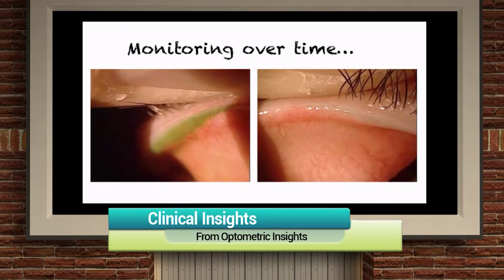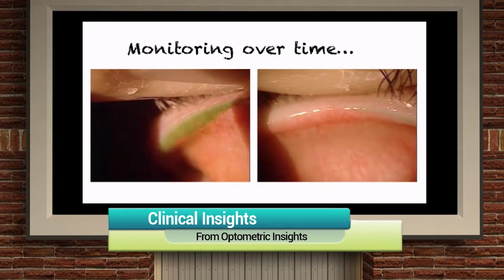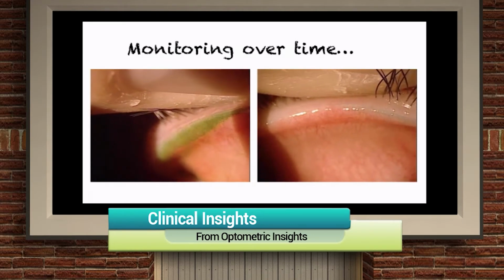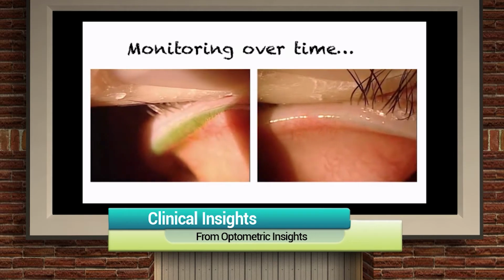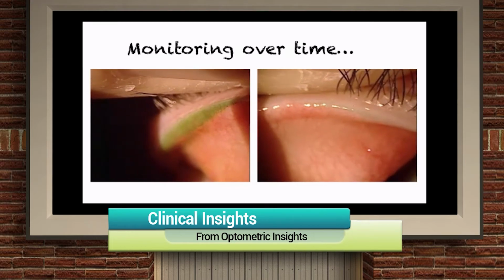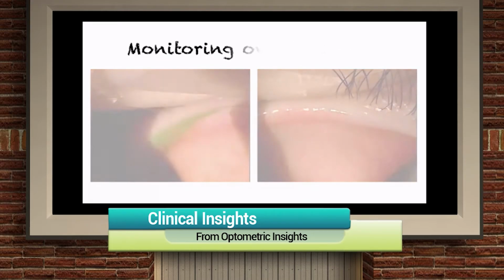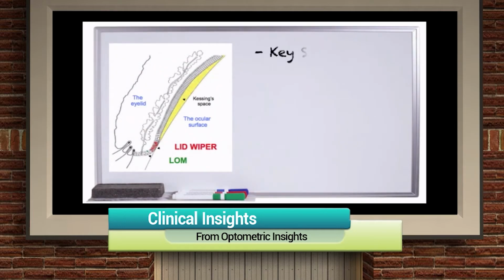In addition to assessing lid wiper area to uncover epitheliopathy, it is also valuable to monitor it over time as you manage your dry eye patients. In this patient in particular, you can see significant improvement in the lid wiper epitheliopathy over time, with the left video demonstrating the lid wiper epitheliopathy noted prior to treatment, and the right video demonstrating lid wiper staining after 3 months of treatment. Because of the importance of the lid wiper area, we recommend assessing it on every patient at every encounter.